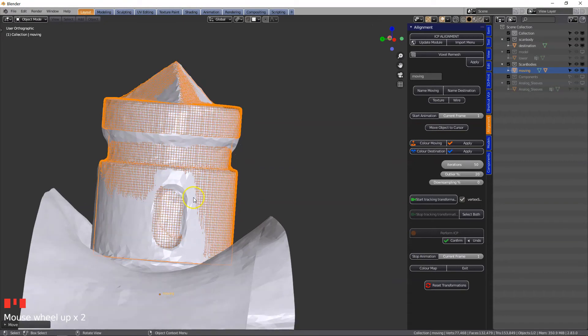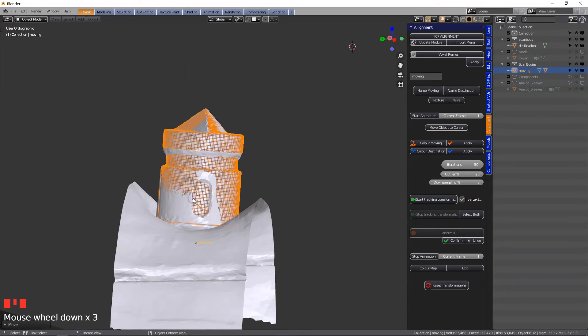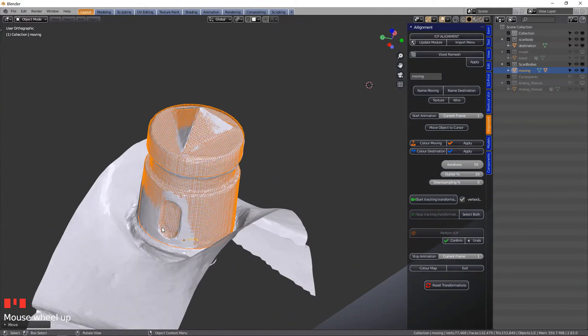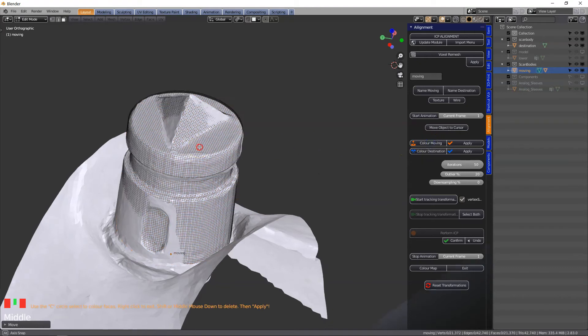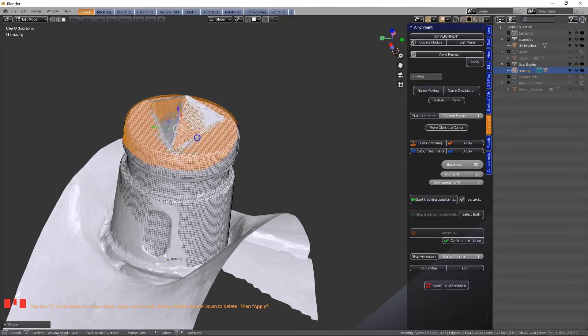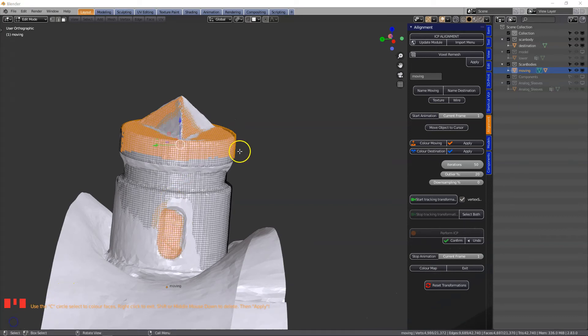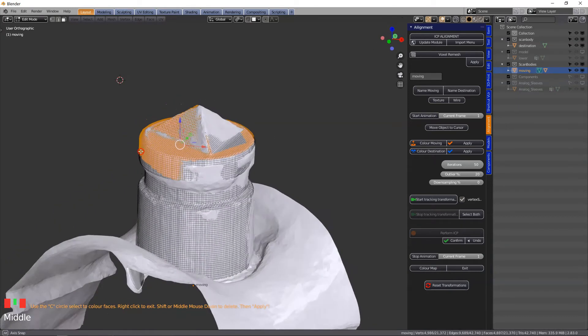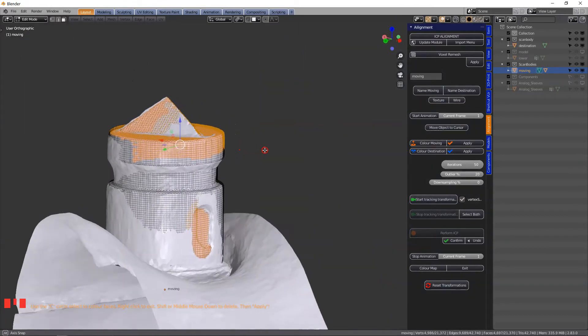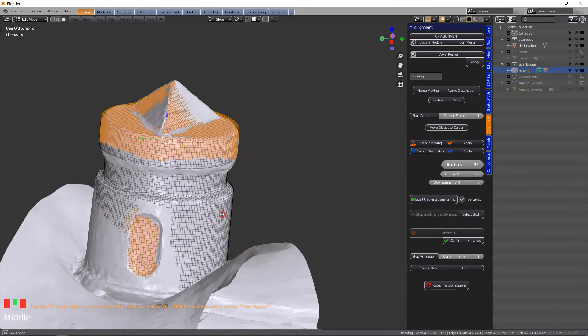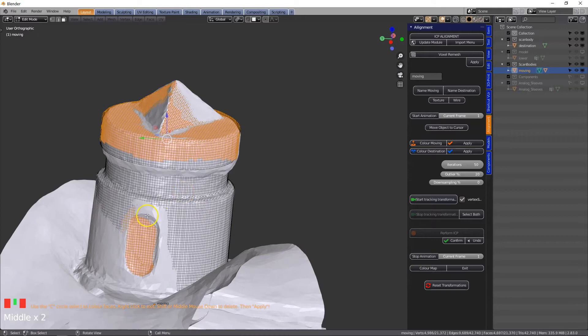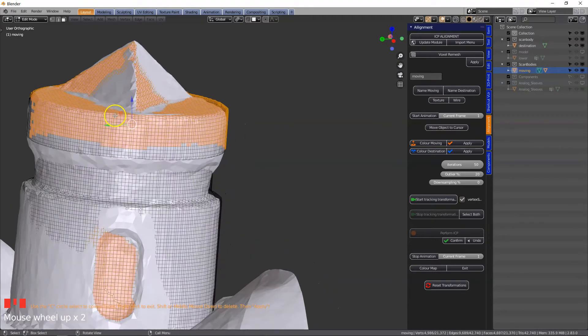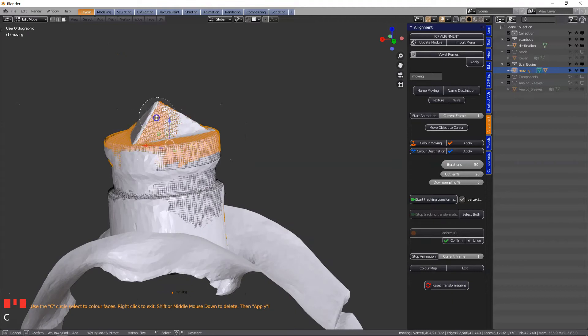Once you've got them closely aligned we will perform the ICP algorithm. But before then we need to color the objects. Click on color moving. Use the C key. Always remember we're working with X, Y, Z axis. It's no use only coloring the cylinder because it will rotate within the cylinder. We need adequate anti-rotation and we need a stopping point on the Z axis. This is very important.